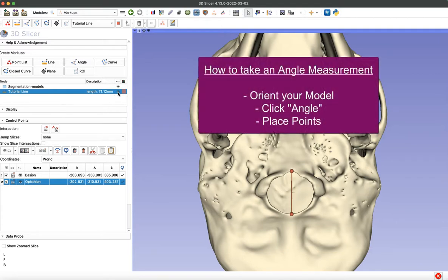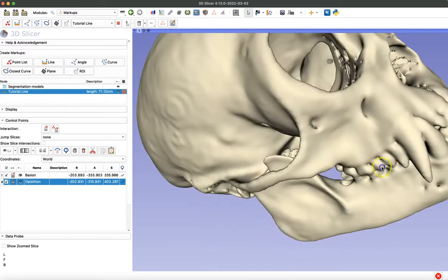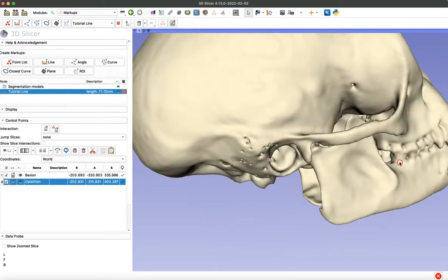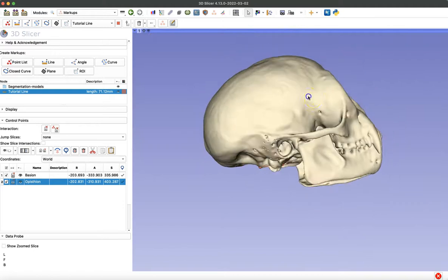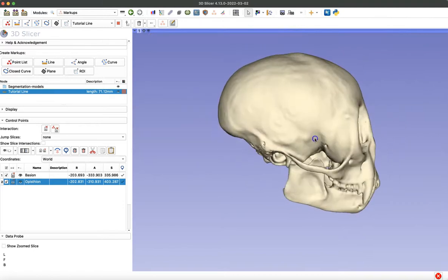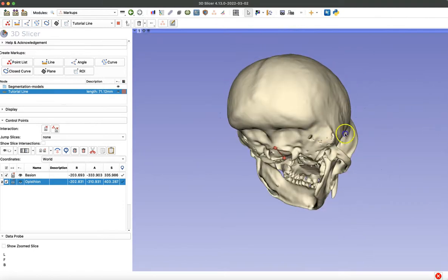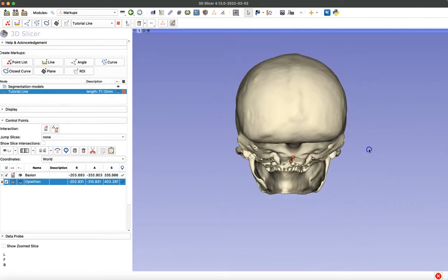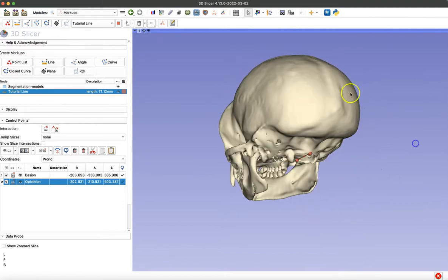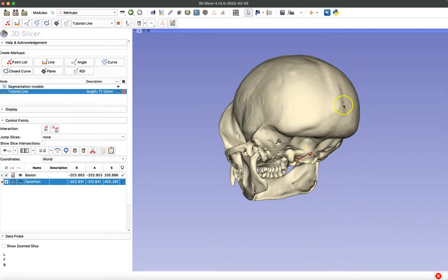So now we're going to cover how to take an angle measurement. It's a very similar process to the one we just went through. You want to orient your model, click angle instead of line, and then we'll be placing coordinate points. So I'm going to first orient that model, this time into a posterior perspective, so I can take the point lambda on the back of the skull.